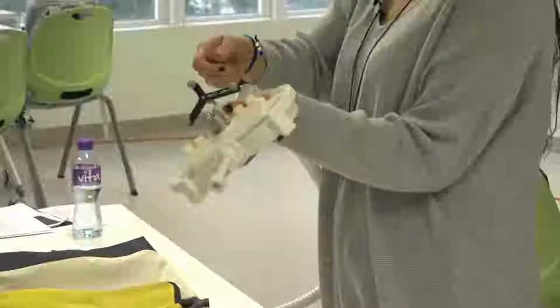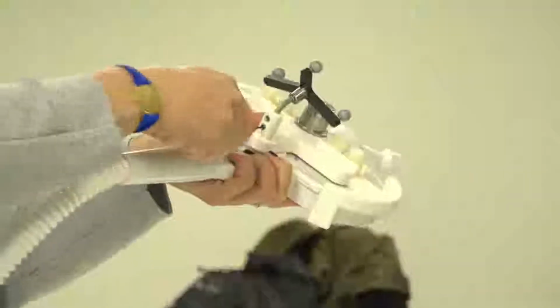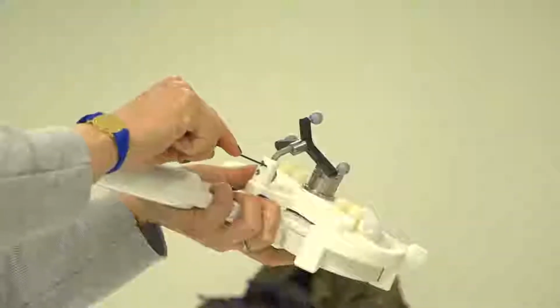Because if it moves, you have a wrong position of the coil. BrainSight is not the same as the other system, Localite.